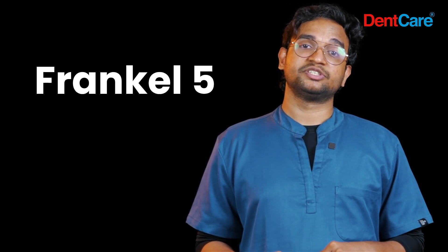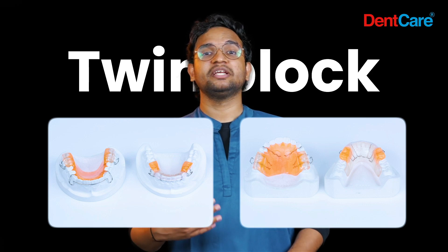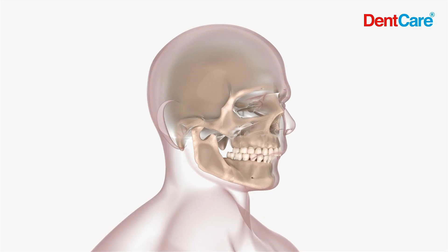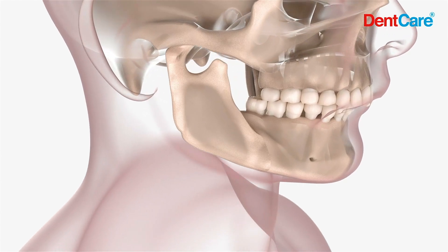Frankel 5 covers cases which require the incorporation of a headgear. We also provide the Twin Block appliance, which is a popular functional appliance designed to be worn full time and mainly used in the correction of class 2 cases where the upper teeth are significantly ahead of the lower teeth. It consists of two separate inclined bite blocks that cover the upper and lower posterior teeth, promoting the forward growth of the lower jaw and improving alignment of the upper teeth. It can also incorporate screws in the upper arch to achieve simultaneous expansion of constricted arches.